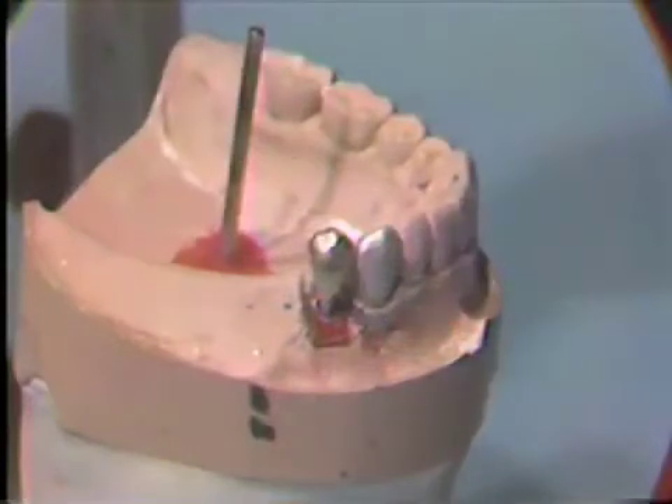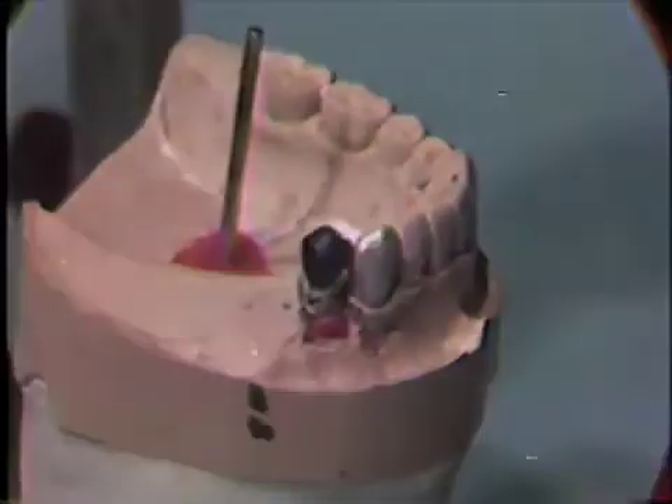A surveyed crown must be fabricated so it occludes with the opposing teeth as well as has the correct contour for the clasp unit to be used on the partial denture. To ensure an acceptable surveyed crown, the crown must be waxed up to include proper anatomy, contact, and contour, as well as ideal occlusion with the opposing teeth.